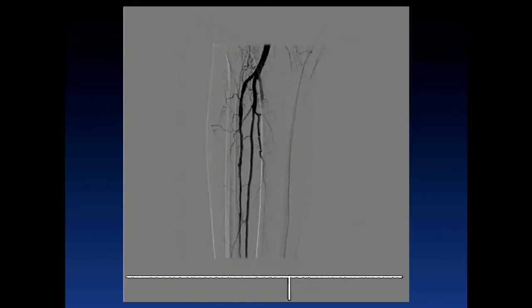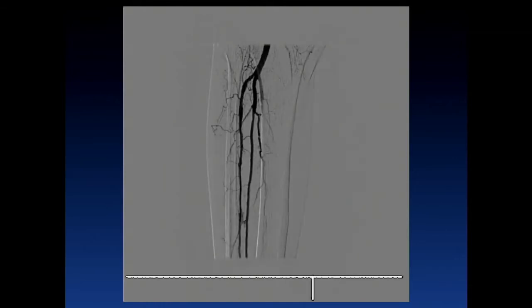It's funny because, Ehrin, he wasn't in the area where this most severe residual disease was. Exactly. We're trying to fix the more proximal area. Yeah. He's more distal. Yeah, the more proximal area looks pretty good now. I wonder actually if the edge of the balloon was there. Is it possible that the edge of the balloon was there? Maybe, I don't know. It was a long balloon. It may be. It was a long balloon, and I think it ended just near that region, so that may have been partly just resulted in a tear.